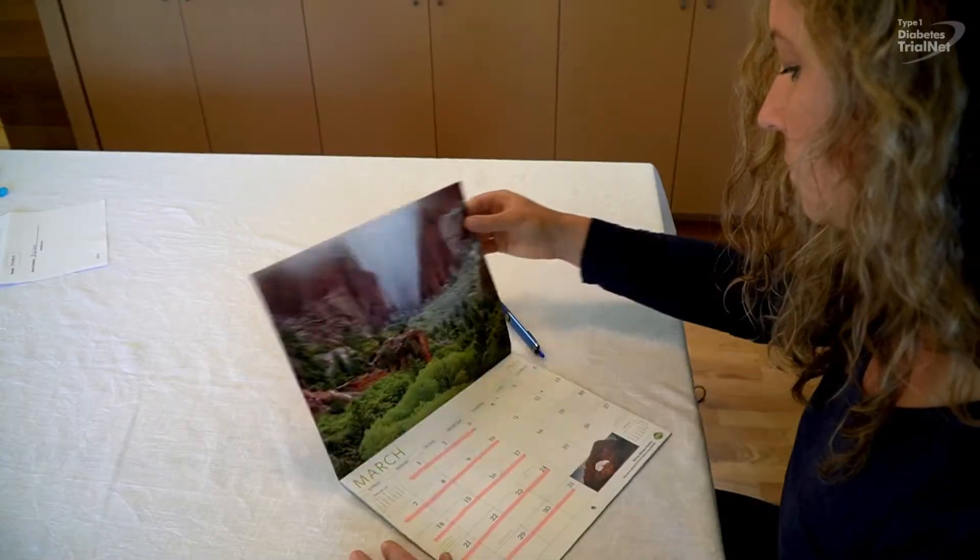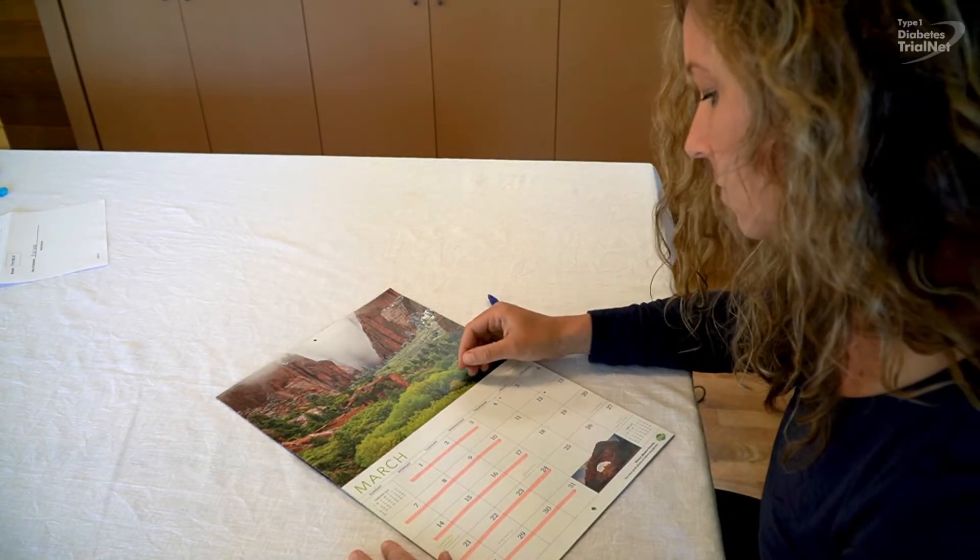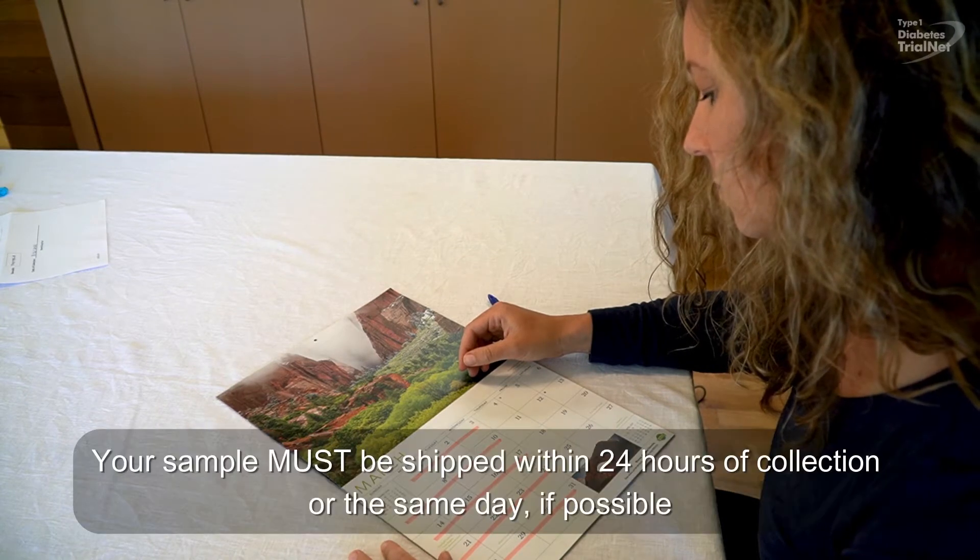Please collect the sample on a Sunday afternoon, Monday, Tuesday, or Wednesday, so it can be shipped overnight and arrive at the lab on a business day.